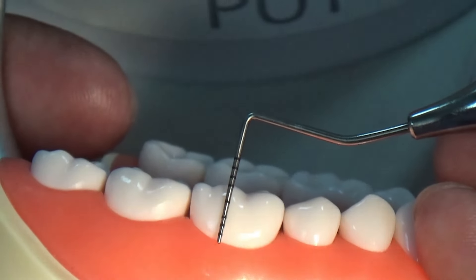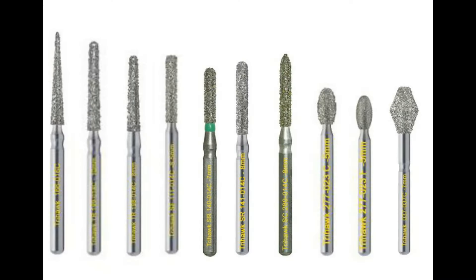Measure the tooth which is going to be prepared before you start the preparation. These are the different types of burs used for posterior tooth crown preparations, including the tapering fissure bur, the tapering rounded end bur, the straight fissure bur, the straight rounded end bur, and torpedo shaped, football shaped, and diamond shaped burs.